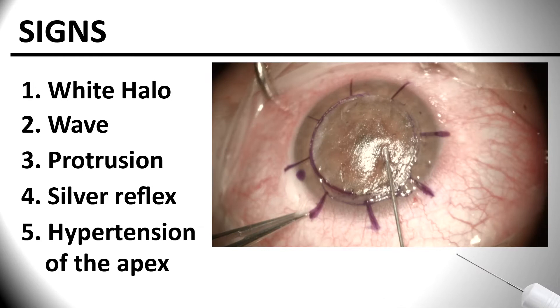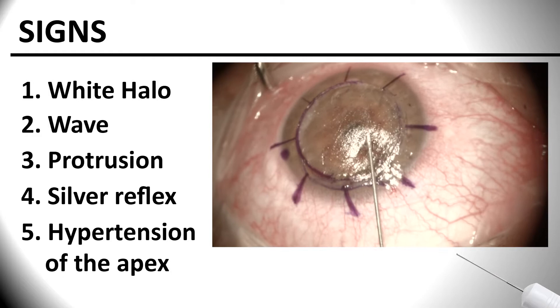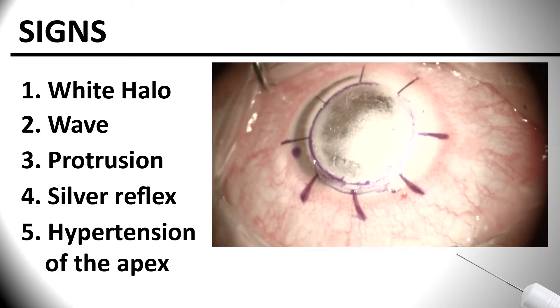Most of the time the bubble is formed correctly with fewer injections and it's evident. There are five signs to corroborate the correct formation: white halo, wave, protrusion, silver reflex, and hypertension of the apex.